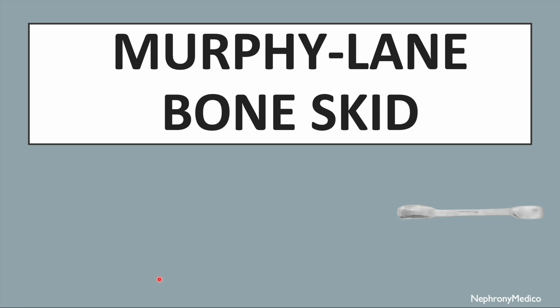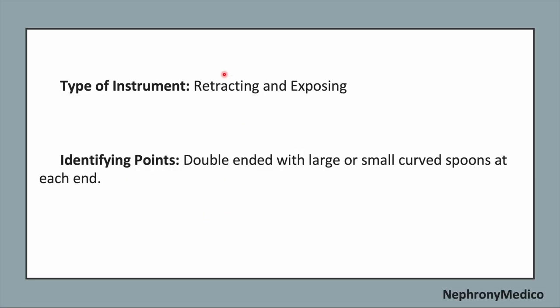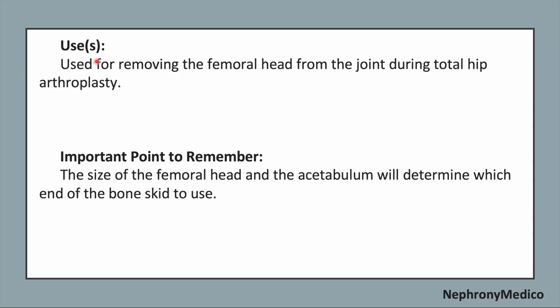Let's talk about Murphy Lane bone skid. This is a picture showing Murphy Lane bone skid. It is a retracting and exposing type of instrument. Identifying points. The double-ended instrument with large or small curved spoons at each end. Use. It is used for removing the femoral head from the joint during total hip arthroplasty.